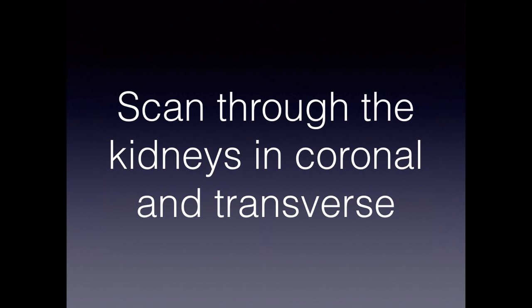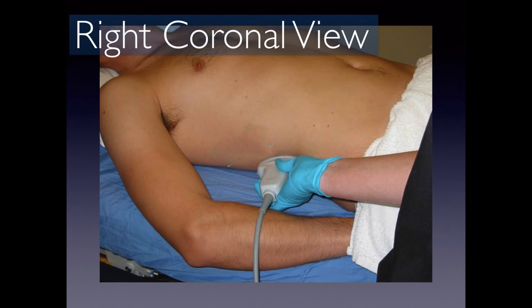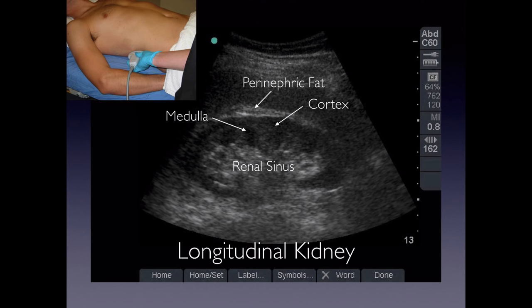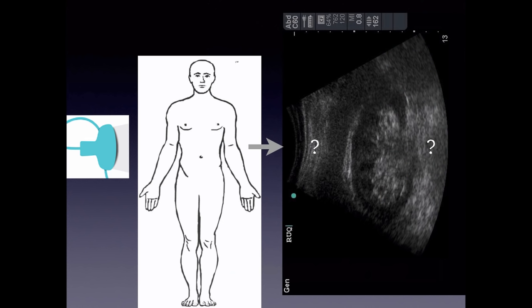You want to scan through the kidneys in coronal and transverse planes. For the right coronal view, you can see how the probe is placed with the indicator up towards the patient's head to get a longitudinal image of the kidney. You'll see the perinephric fat, the cortex, and then the medulla, which is slightly hypoechoic compared to the cortex. The renal sinus appears bright.